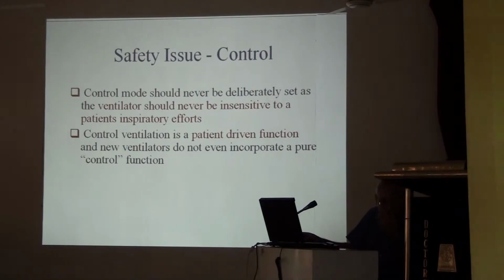Safety is needed for this control device because it is a very unintelligent mode of ventilation. The control mode should never be deliberately set, as the ventilator should never be insensitive to a patient's breathing. So this classical ventilatory feature was the industry standard, but now most of the sophisticated manufacturers have abandoned this classical control system.